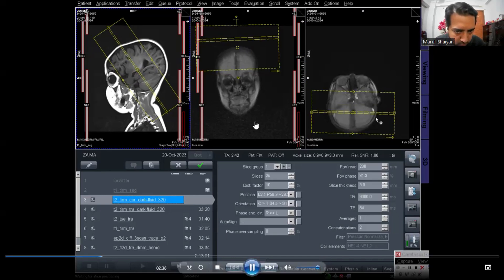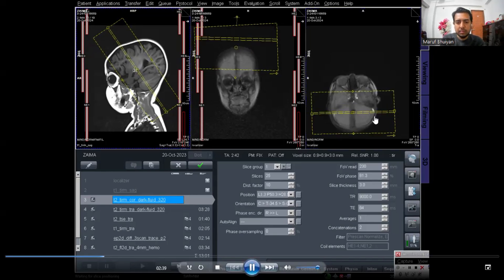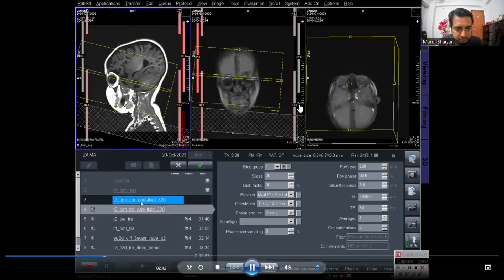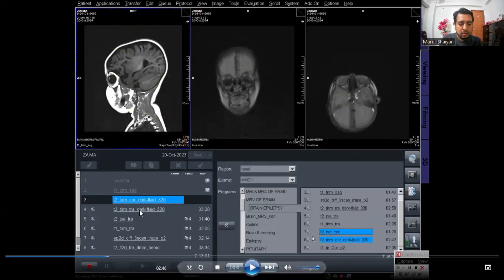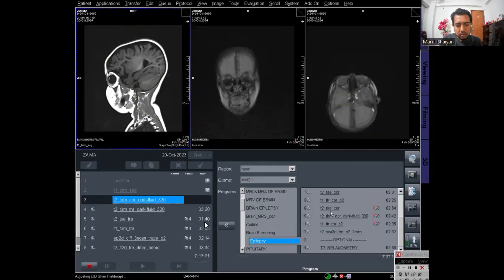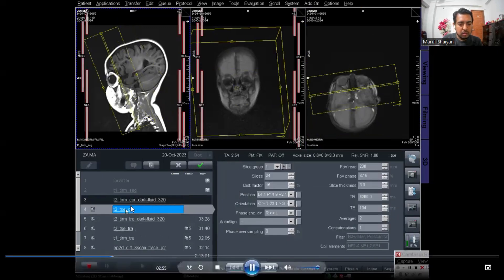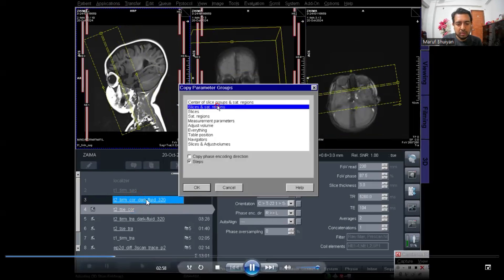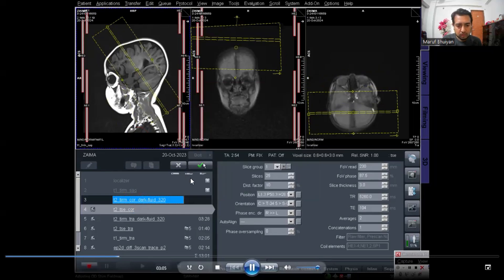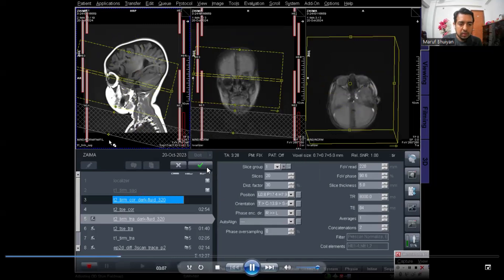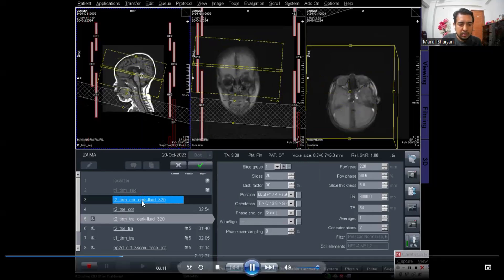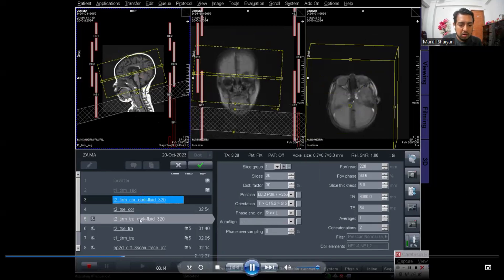Also plan on the axial images so that the slices are parallel on both sides. Copy the planning and apply it to the T2 coronal. I am dragging the T2 coronal and copying the planning from the T2 FLAIR coronal that I planned for epilepsy. The plan is copied — click Apply. The protocols are now running: T2 FLAIR coronal is complete.